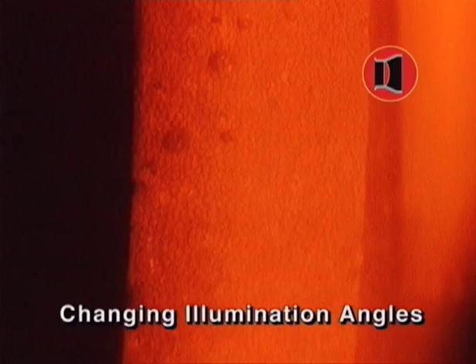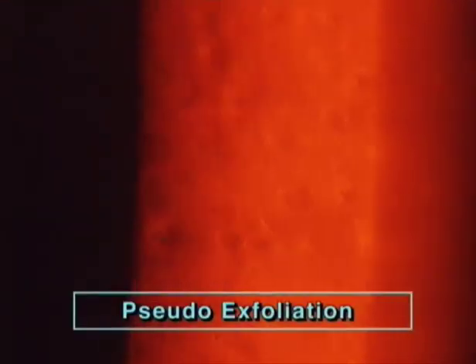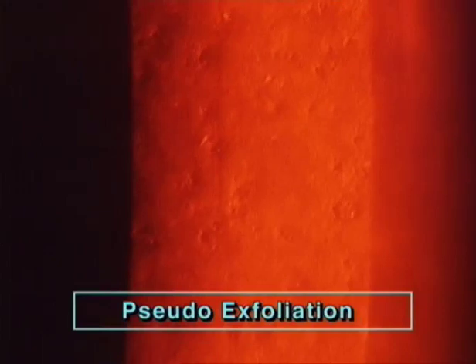If we change the illumination angles constantly, we can distinguish between pre- and retroendothelial phenomena, as seen here in a pseudoexfoliation syndrome with drusen. Here we might presume a defect in the endothelial layer, but just a slight change of illumination proves the endothelium to be intact. Some of the large bosses actually are not drusen but retroendothelial phenomena.